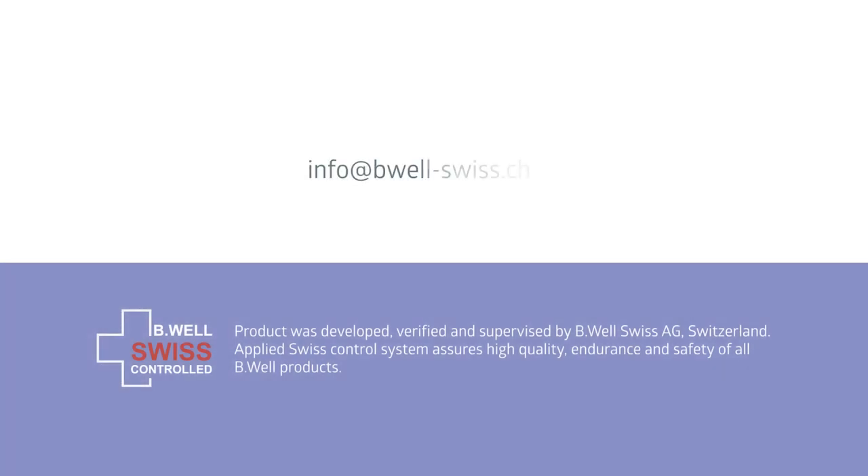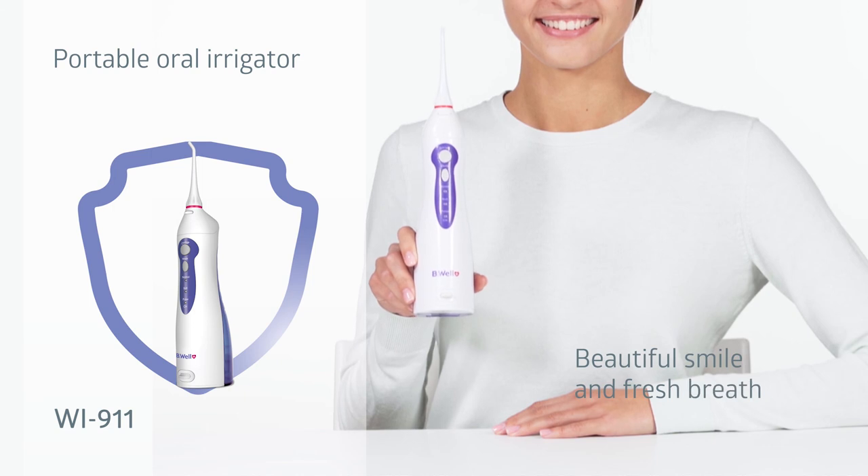Be Well guarantees the quality and high level of maintenance service. You can always consult our specialists and purchase required accessories. Be Well, caring for everyone.